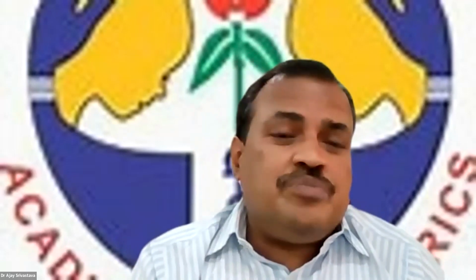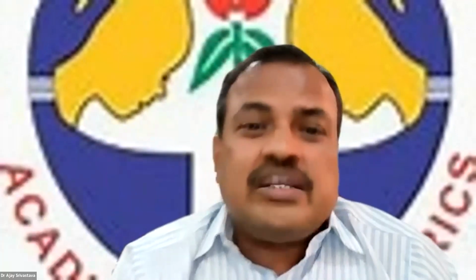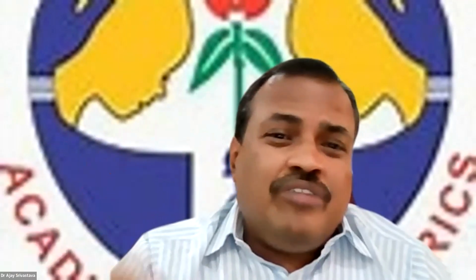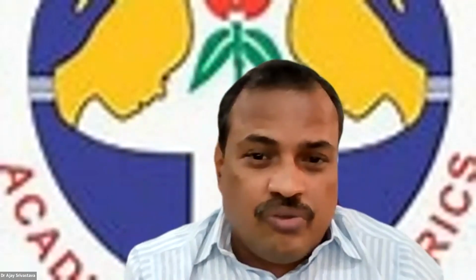इसमें हम लोग वही पिक कर सकते हैं जो थोड़ा सुपरफिशियल है, जो थोड़ा कॉर्टिकल है. इसका इटियोलॉजी नहीं पता कर सकते. It has relatively low sensitivity. इसको करीब 500 टाइम्स और 1000 टाइम्स जब ऑगमेंट करते हैं तब जाकर उसकी ट्रेसिंग आती है. And these are subject to both physical and electrical artifacts and influenced by a state of alertness, hypoglycemia, drugs.